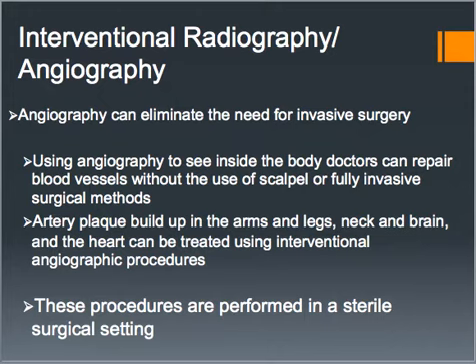One of the most impressive things to me about angiography is that it can eliminate the need for invasive surgery. So we talk about studies that are non-invasive, minimally invasive, and invasive. So something that would be non-invasive would be MRA or CTA. And that's great for just diagnosing things. But you can't do any treatment during those procedures.